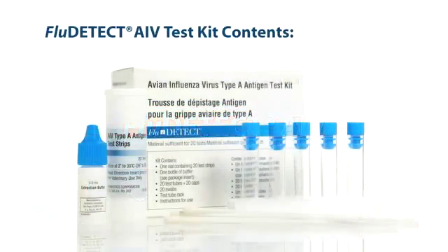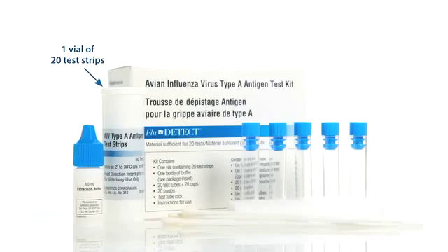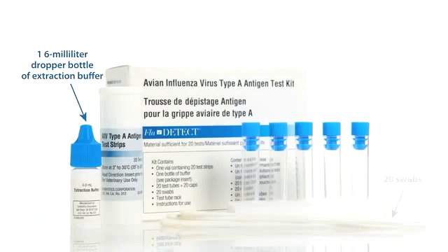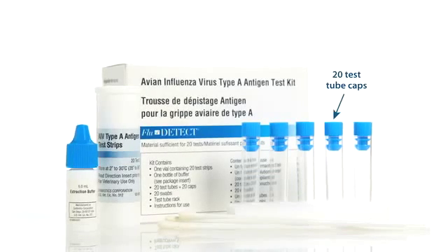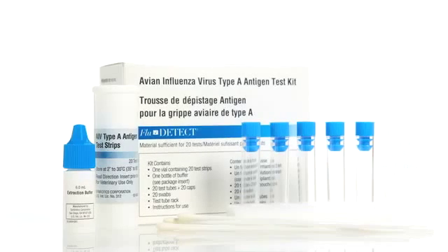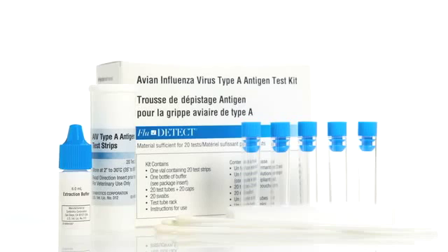The following items are packaged in each FluDETECT AIV test kit. 1 vial of 20 test strips. 1 6 milliliter dropper bottle of extraction buffer. 20 swabs, 20 test tubes, 20 test tube caps, 1 test tube rack for 5 test tubes, and 1 directional insert. Be sure to examine the test kit contents before testing begins.